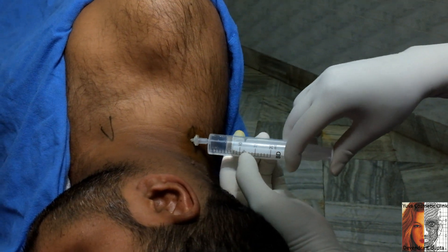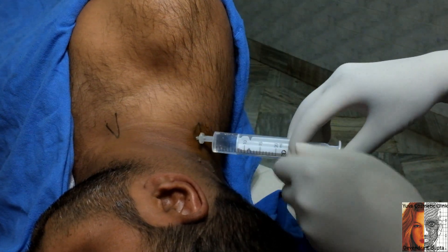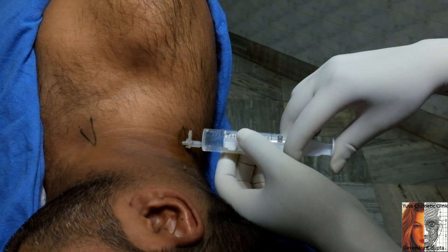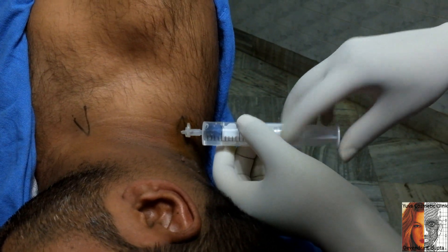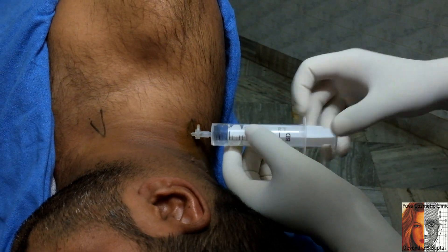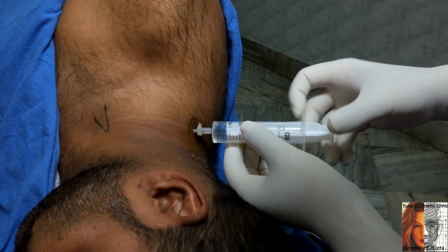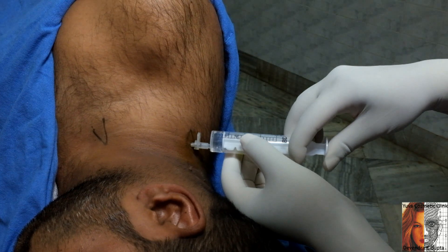Again there is free flow and the movement is transmitted in the correct plane. I have used a very dilute solution of bupivacaine and 2–3 ml of xylocaine with adrenaline, so the result of this block will last more than 10 to 12 hours. He will have very mild motor paralysis and a little bit of sensory loss.